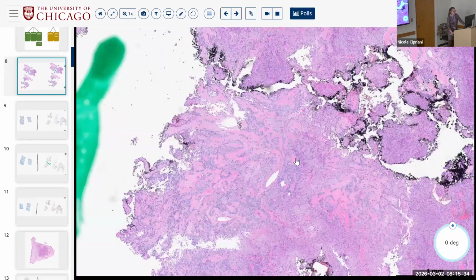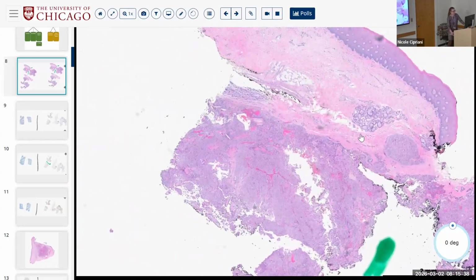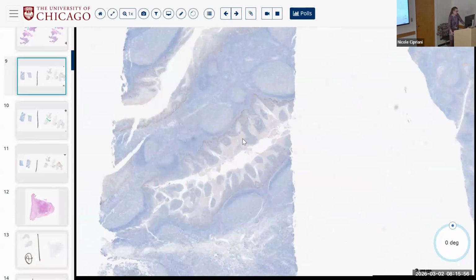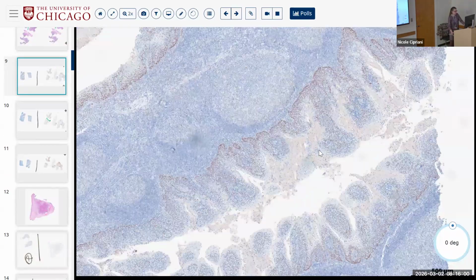Okay. So in minor salivary gland, tumors may be unencapsulated, but still be benign, right? So that's an okay thing. So if we're gonna go with our, I don't even wanna come up with a differential yet. I just wanna throw my P40, my C-kit, and my S100 on. Fine, you win. So here, let's check our normal control, right? So that's nuclear in the tonsil, so that's P40.